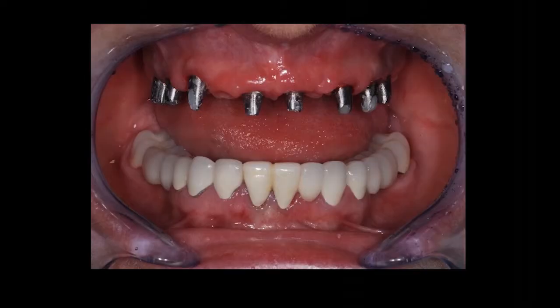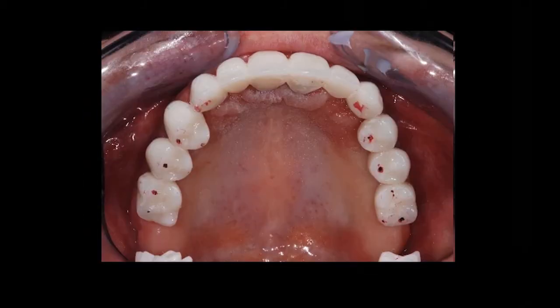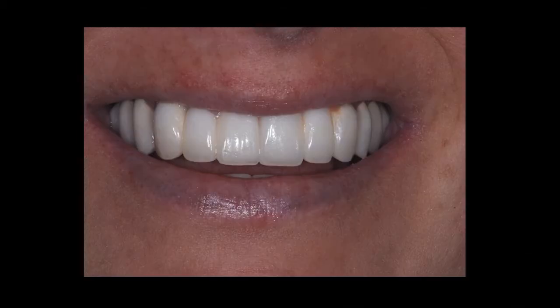You know, I came in and put some stock abutments in, put her in temporaries. Then I sent her back to Mike. He didn't want to use the stock abutments. He made all custom abutments for her. But these are his temporaries. So here she is provisionalized. He kept in provisionals for a good while, make sure the aesthetics was good and phonetics and all that other kind of stuff. And so here she is during the provisional phase.